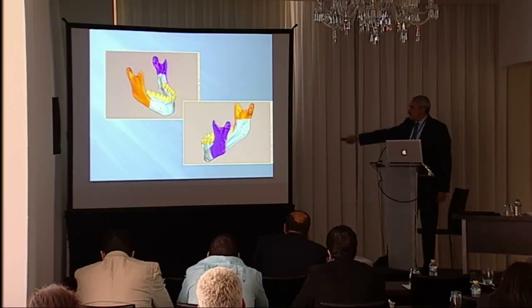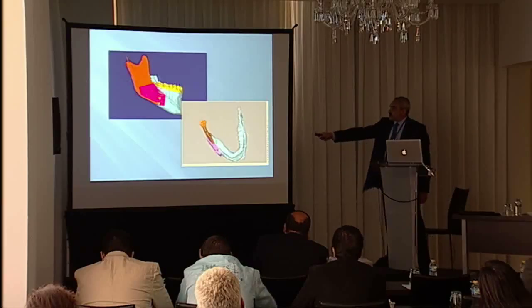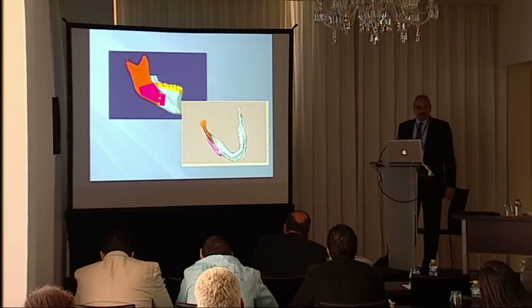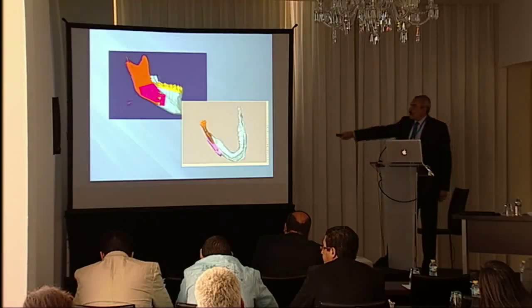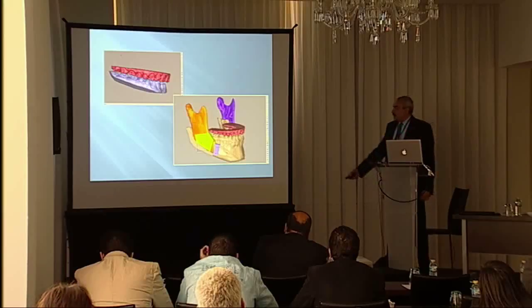Then we design the CT scan cuts, and we start now by doing the template that fits on what we call the proximal segment and fits on the distal segment with the use of these two rods. And we fix that preoperatively, then we take it out and fit another, identical one, with the difference being in the rod length and the rod direction for the postoperative phase.